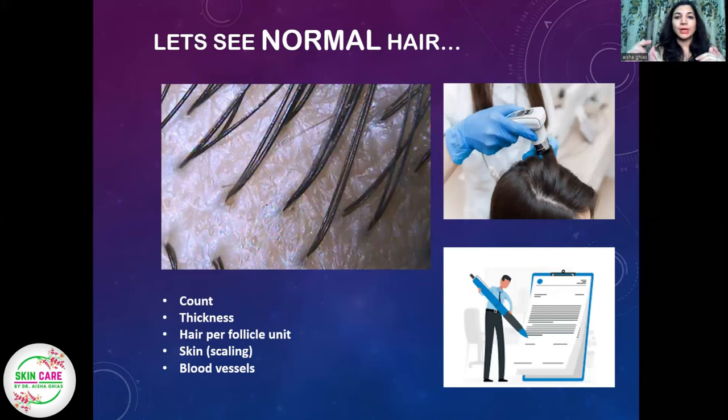It's the 1 centimeter square area that is being studied with the help of trichoscopy, and its difference is very important. If you do research on different hair follicle disorders and you use this trichoscopy in that research, you are referring to that area that you studied with the help of trichoscope. Obviously, you're going to monitor the disease. If you are intervening with some sort of drug and you're actually witnessing its results on that hair fall problem, or for that matter, you are just following up the patient, you will be referring again and again back to that 1 centimeter square area at that specific point on the scalp that you used in the first place.